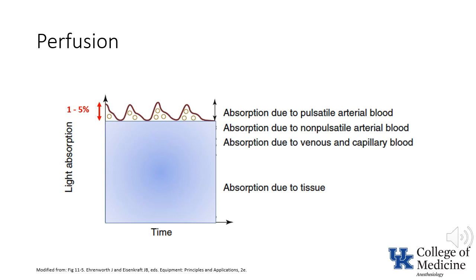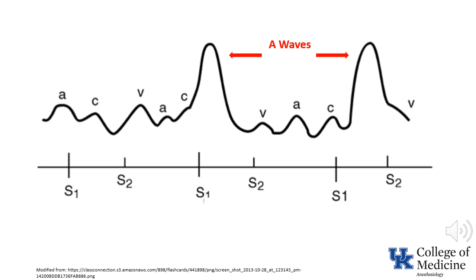One more factor which is not exactly a problem with inadequate perfusion would be anything that causes venous pulsations. While not specifically related to arterial perfusion, the presence of a large amplitude venous wave, such as occurs either with tricuspid regurgitation or Cannon A waves in the presence of complete heart block, may result in spurious values if the oximeter interprets the venous wave as a normal arterial pulsation.